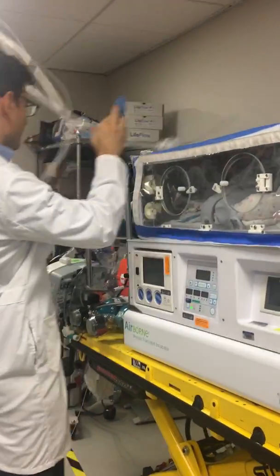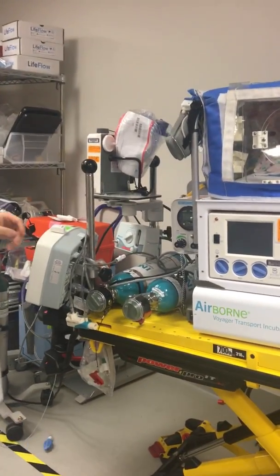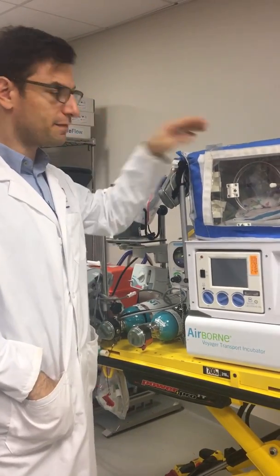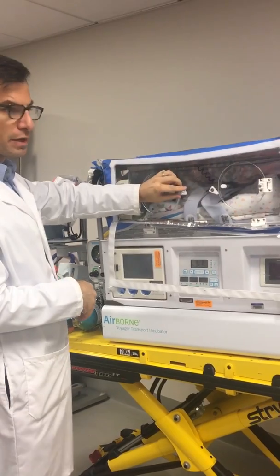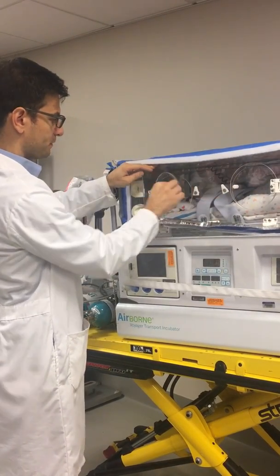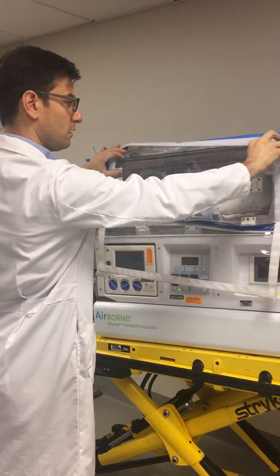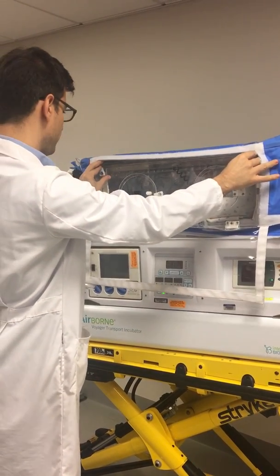This is an Isolet for neonatal transportation — basically for babies five kilograms and less. Anything bigger, we're probably going to be on a stretcher with an LTV. You go through the side port holes here; you can pull this all the way down and access the baby over here.